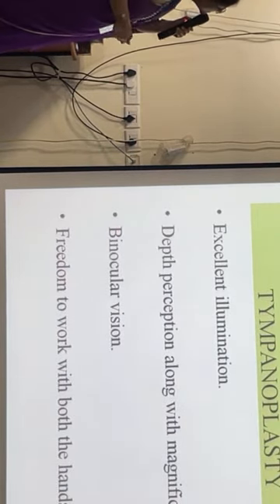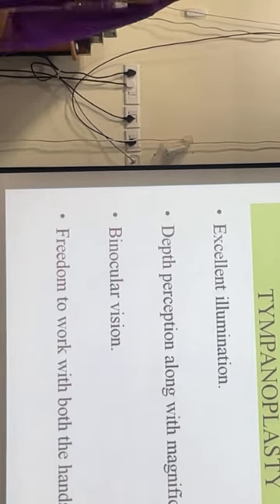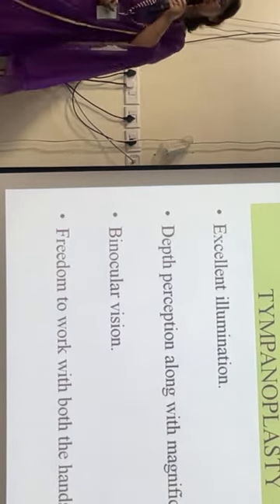Now the advantages of microscopic tympanoplasty: excellent illumination, depth perception. Now this is a very important advantage of a microscope. Depth perception along with magnification, binocular vision, and freedom to work with both hands.